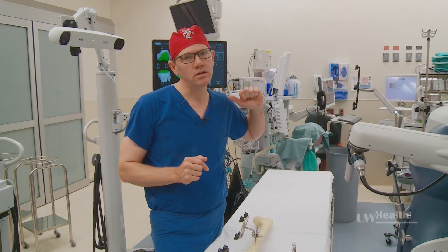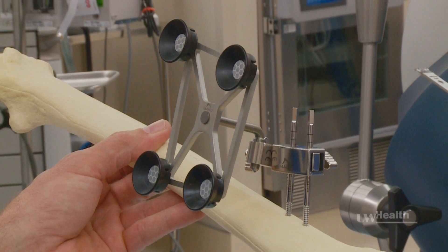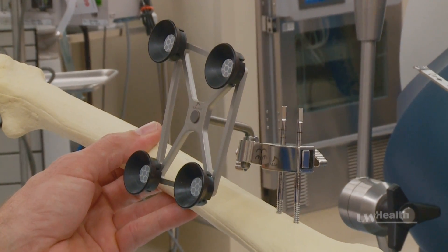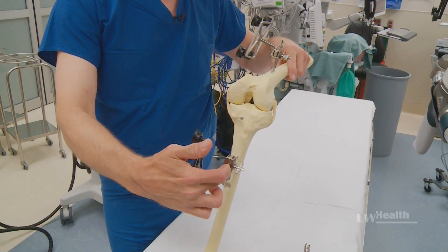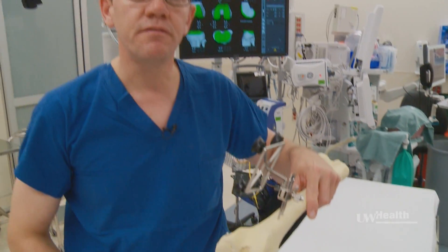The computer knows exactly what they look like. I have to teach it where they are in space. In order to do that you need a reference frame — that's these pins in the tibia and these pins in the femur.